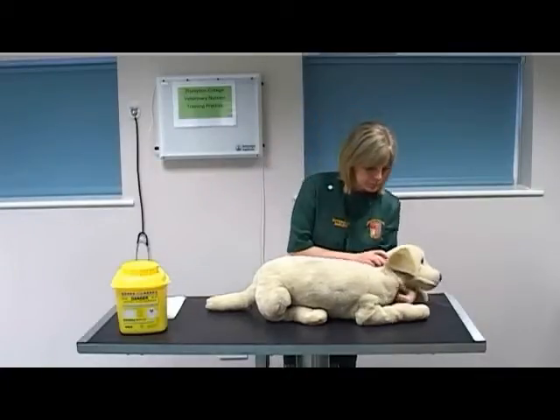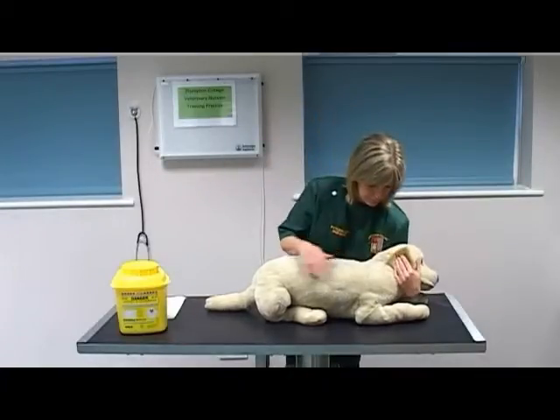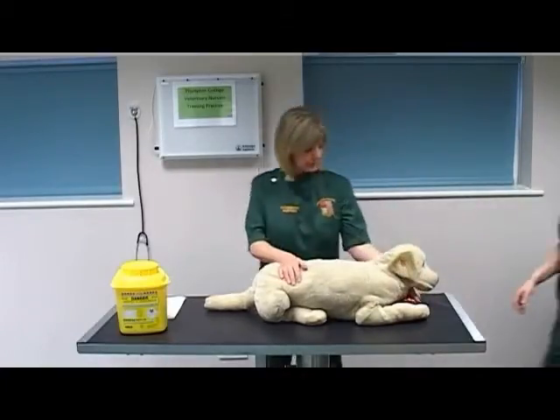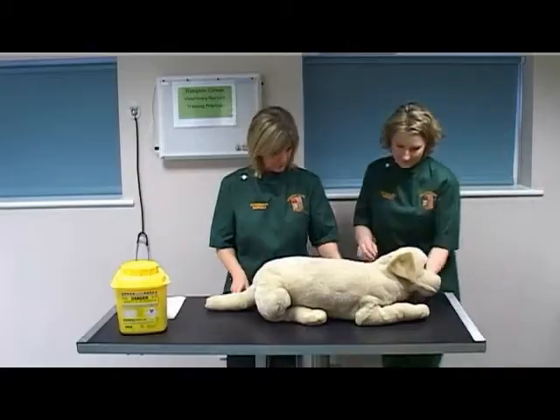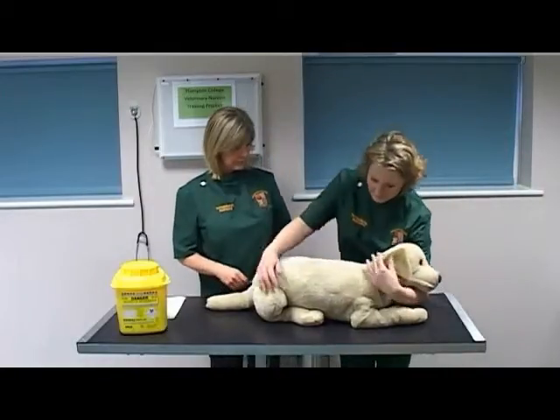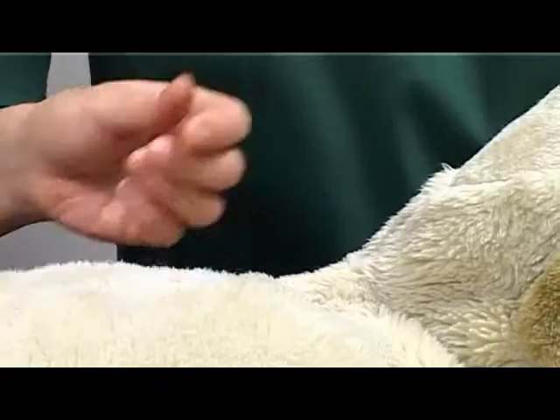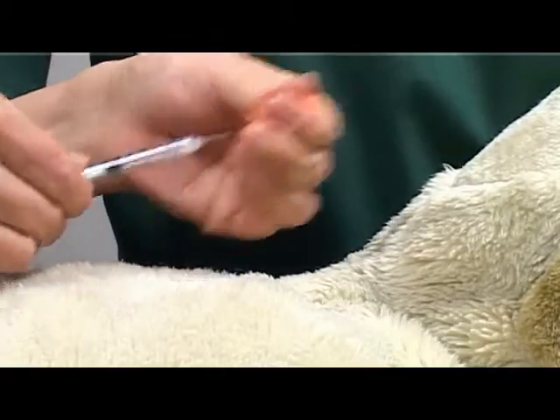Instruct an assistant how to restrain the dog effectively. Select the appropriate injection site — either the animal's scruff or flank.